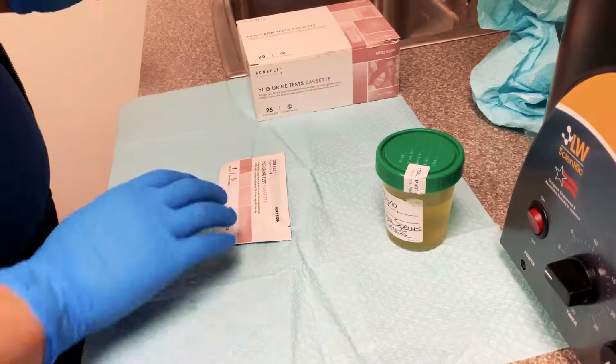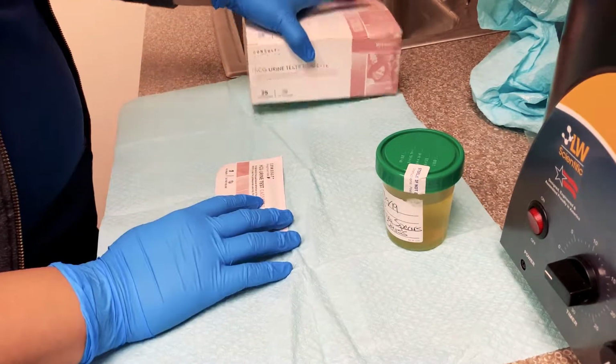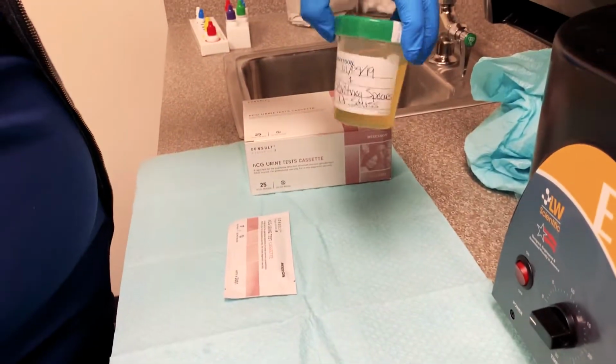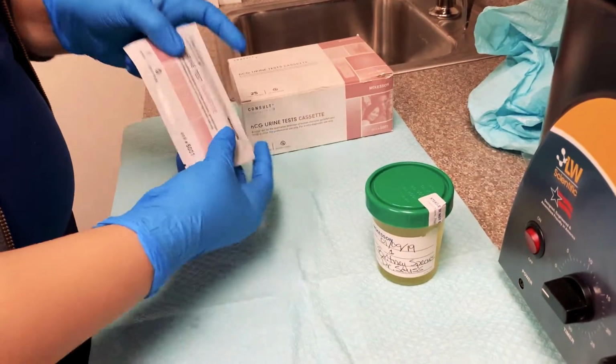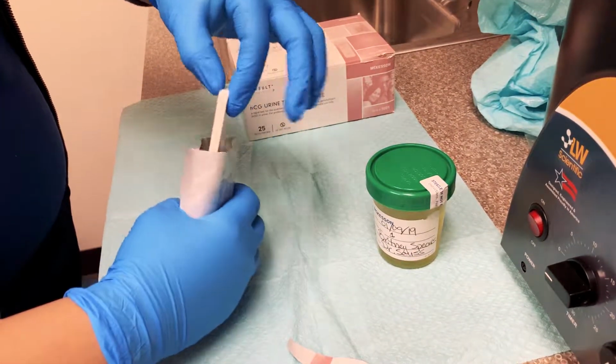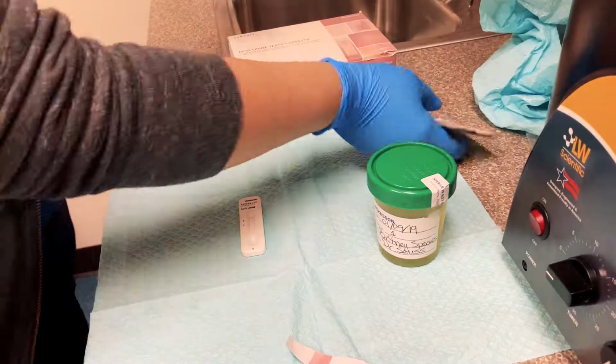Hello everyone, today we're going to be doing an hCG urine test, also known as a pregnancy test. Here's my little box, my urine from my patient, and the actual test. We're going to open this. Here's a little pregnancy test.